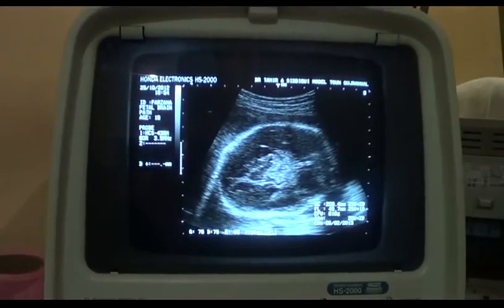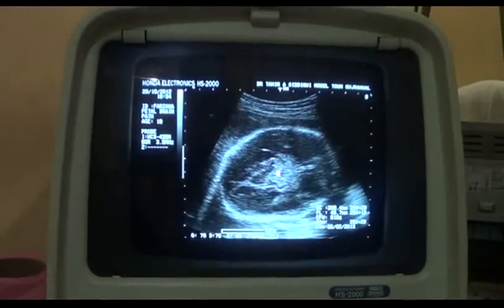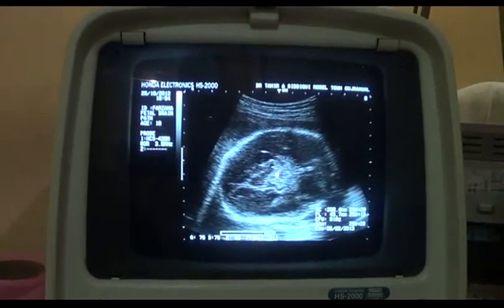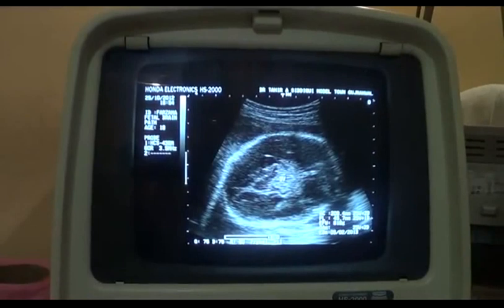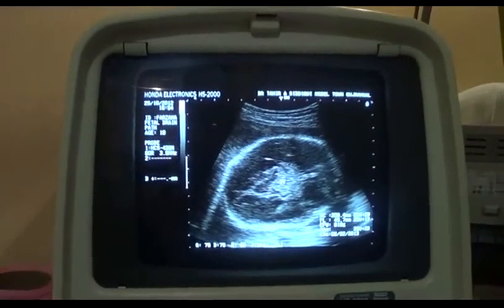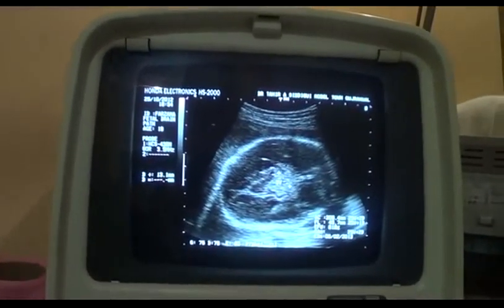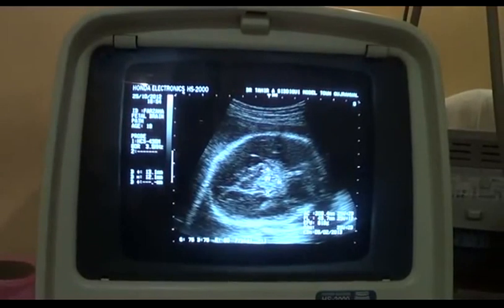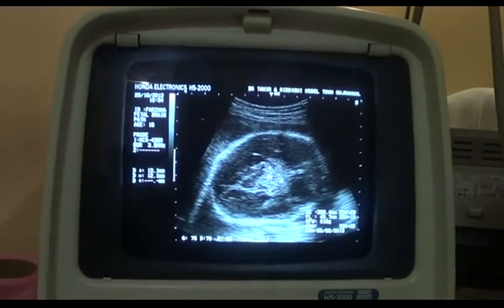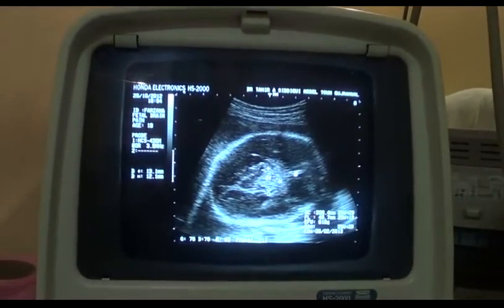This may be bleed, this may be clot within the third ventricle. So this is the third ventricle, this area. And this is the falx cerebri. This is again the falx cerebri.